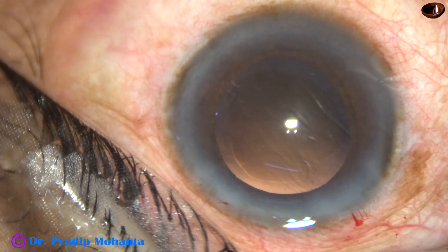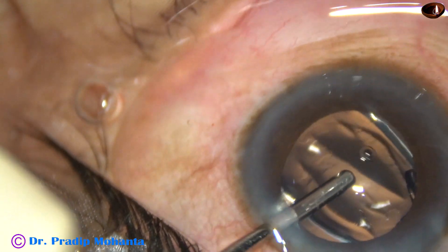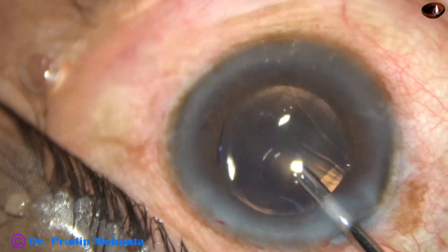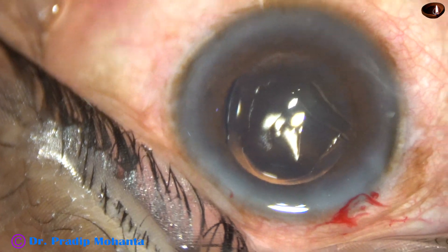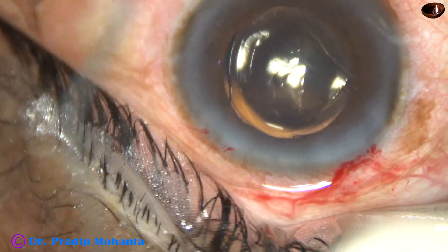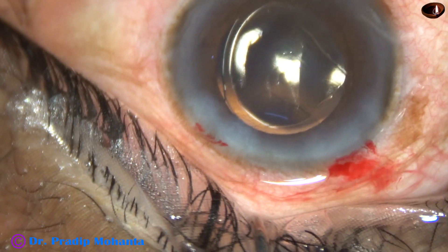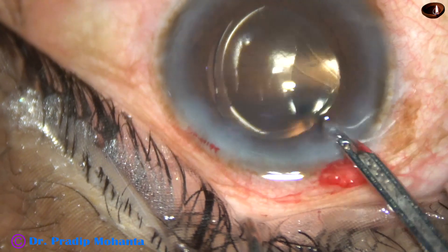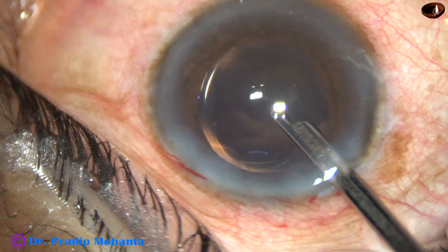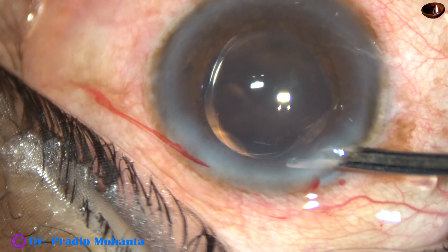A better instrument for polishing is the irrigating probe of bimanual irrigation aspiration. Now this is hydro-implantation of a single-piece monofocal intraocular lens. The lens goes into the capsular bag; the irrigating probe dials the lens, and whatever viscoelastic was in the lumen of the cartridge comes out at this time. Now this is a bit of moxifloxacin. The side port is closed by hydrating the corneal stroma on either side of the stab incision. This is the final lavage of the anterior chamber — some viscoelastic was sticking to the corneal endothelium; a gentle stream of BSS was directed towards the corneal endothelium and the OVD came out. This is formation of the anterior chamber, and then the case is concluded.